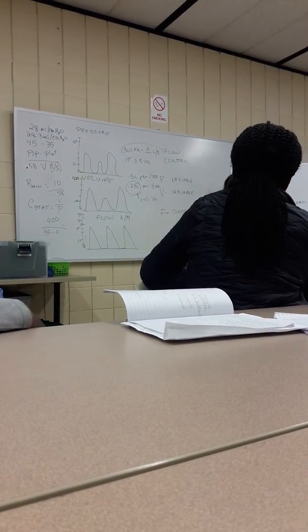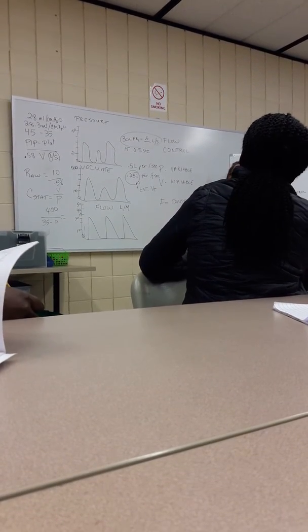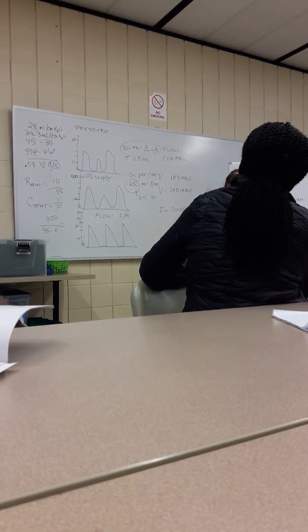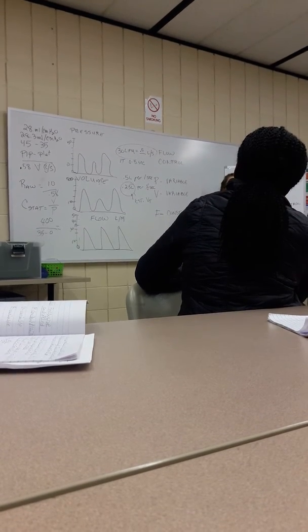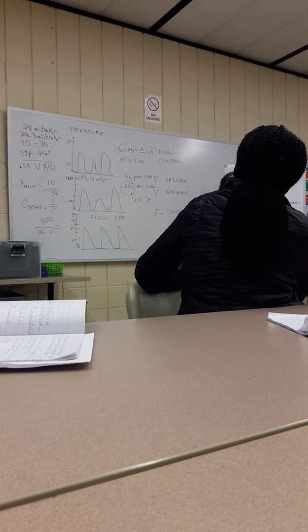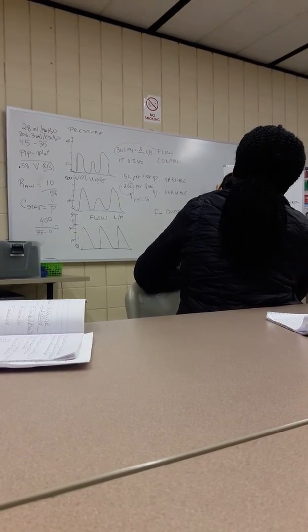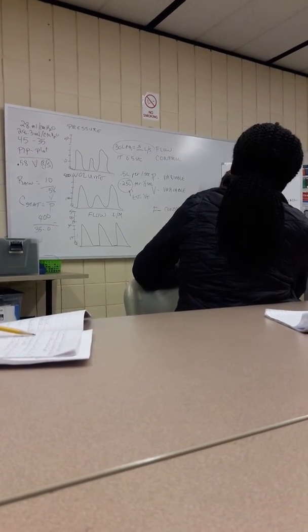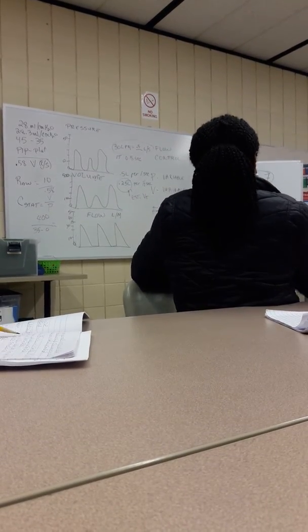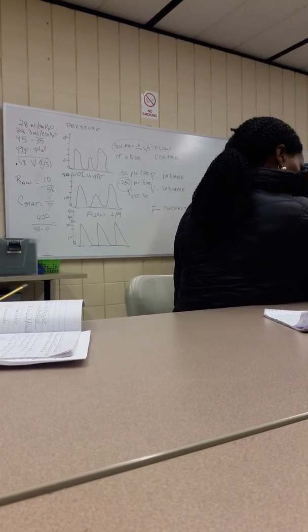Now let's go to volume control. In volume controlled ventilation, what is the limit? Volume. What's variable in volume controlled ventilation? Pressure. In volume controlled ventilation, only the pressure is variable. Flow is constant along with the volume. When you go into your clinicals and you're setting volume ventilation, you are setting a volume and basically setting a constant flow. Have you done volume ventilation?